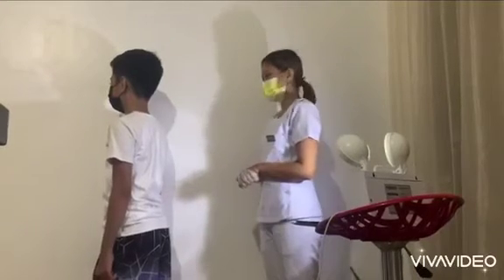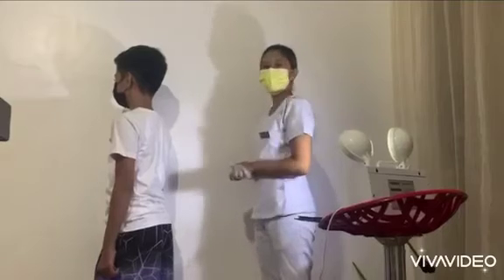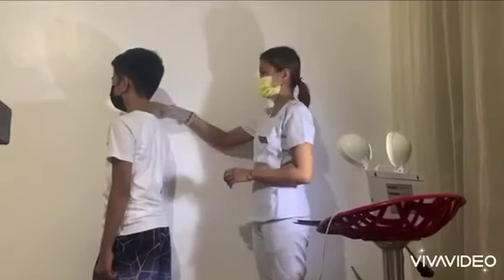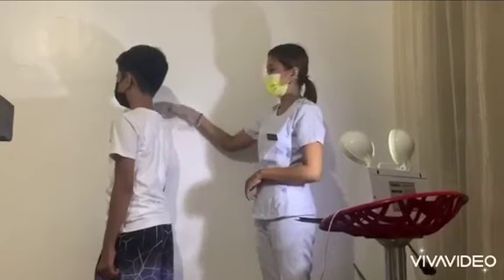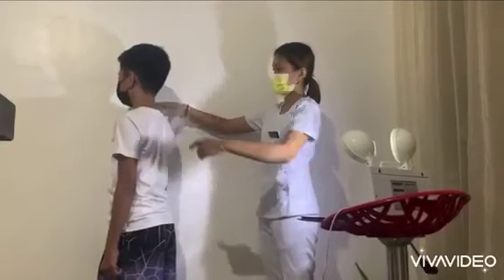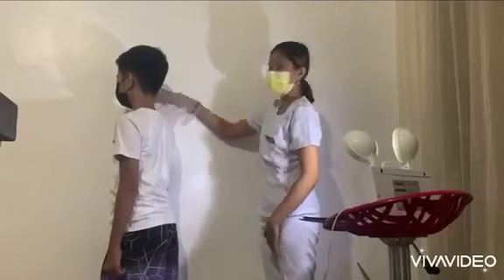Now, what I'm trying to do is make an image where the scapula is lateral, but my central ray is coming through pretty much the acromion or the AC joint.